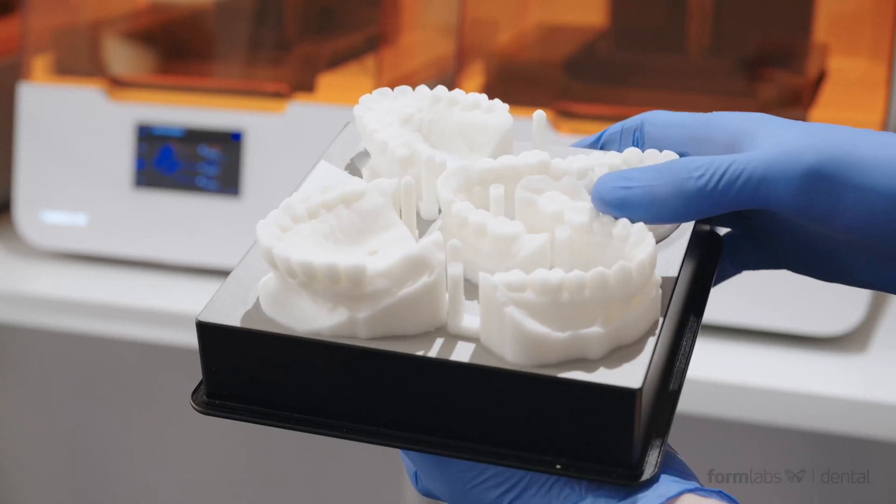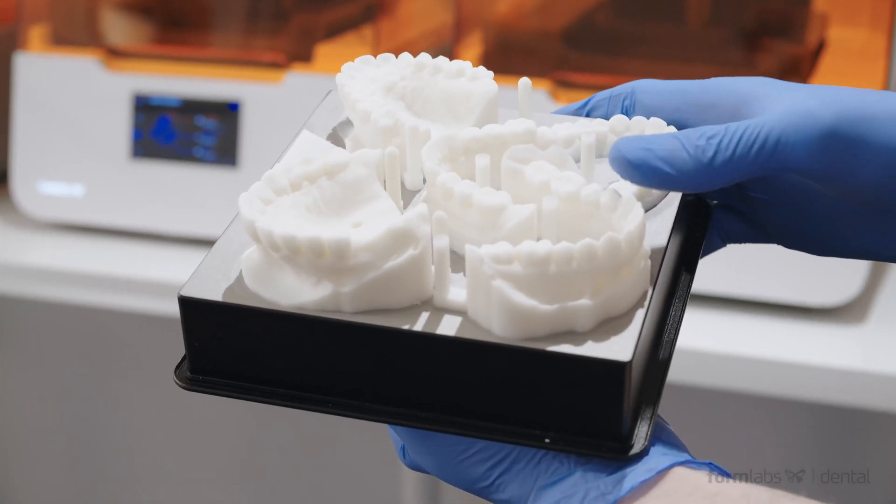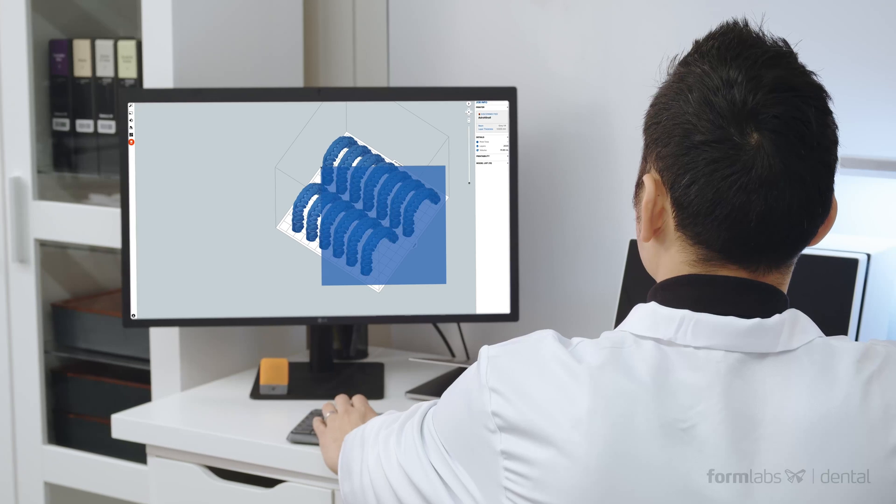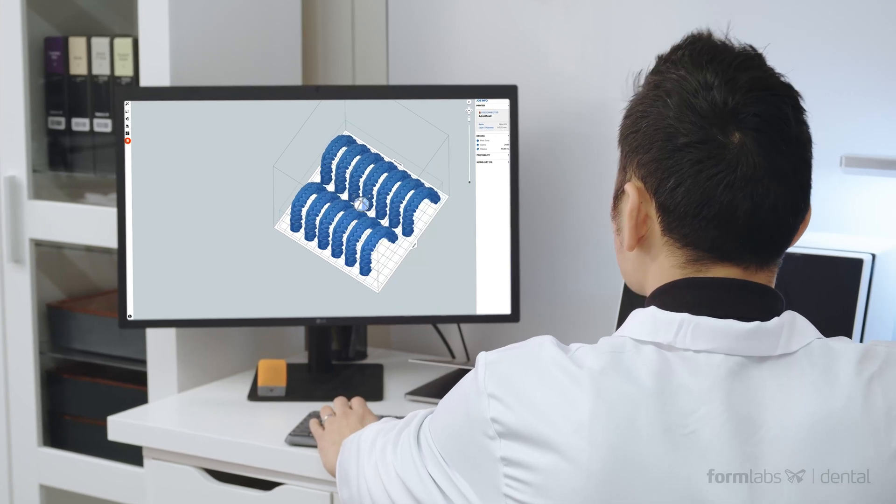All with even better accuracy than ever. The Form 3B strikes a perfect balance between powerful capabilities and an intuitive workflow that's easy to use, even if you're just starting with dental 3D printing.